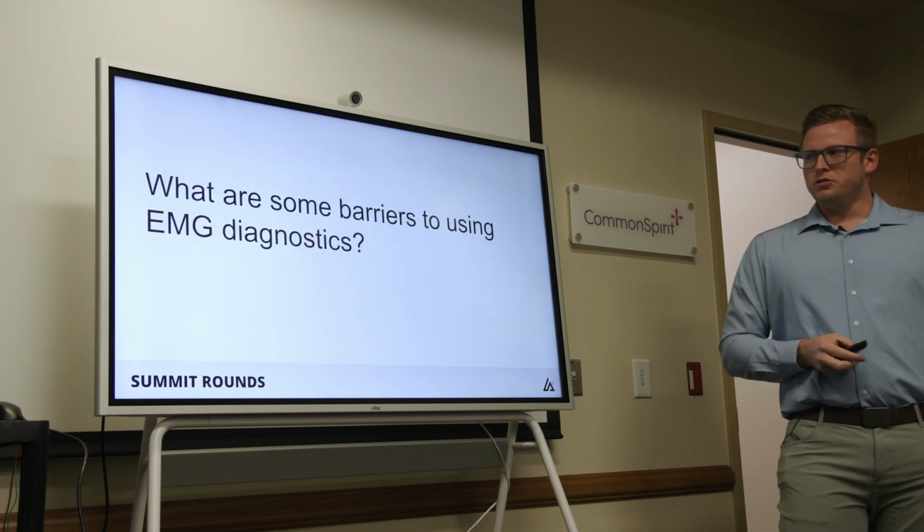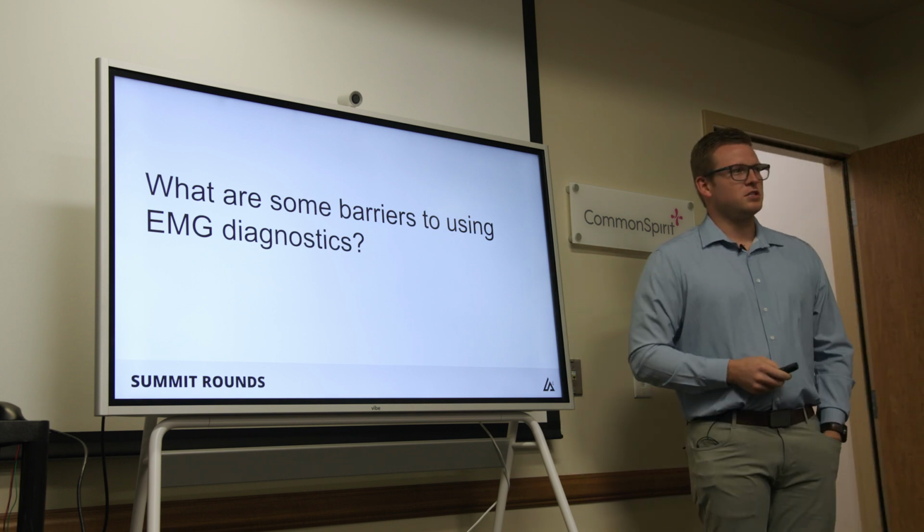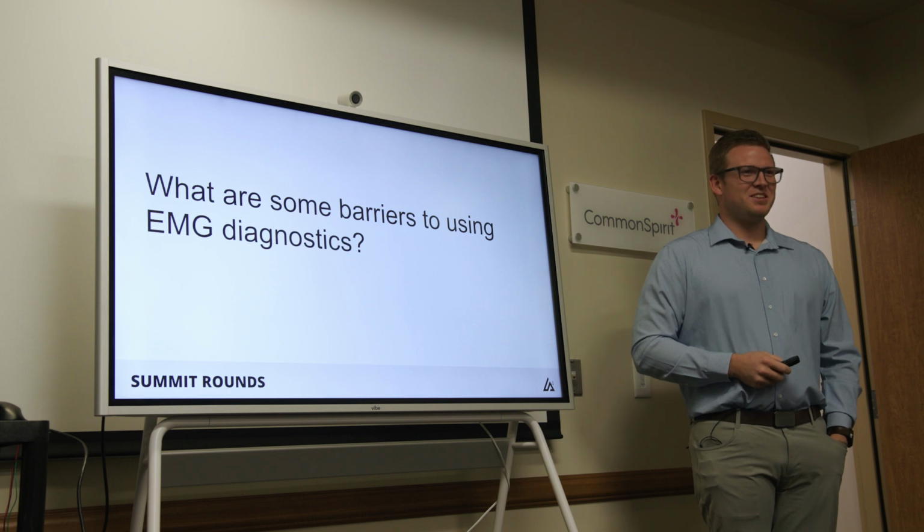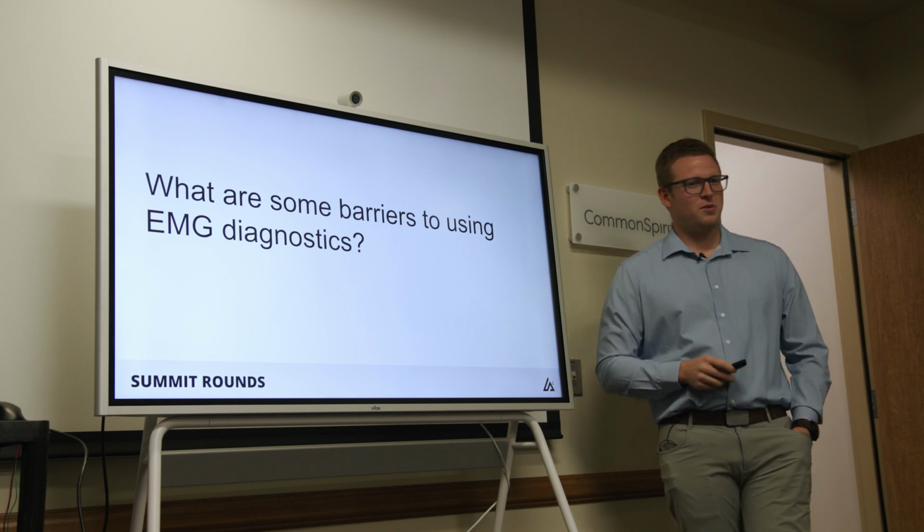What are some barriers to using EMG diagnostics? Just discuss real quick. Needles, yeah. Definitely. Other thoughts off the top of your head?